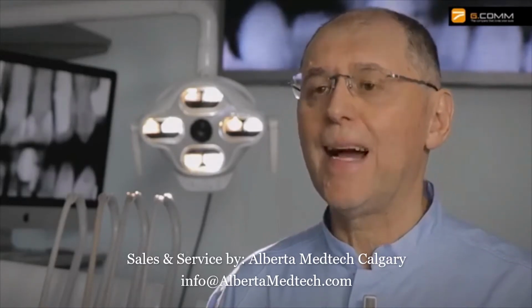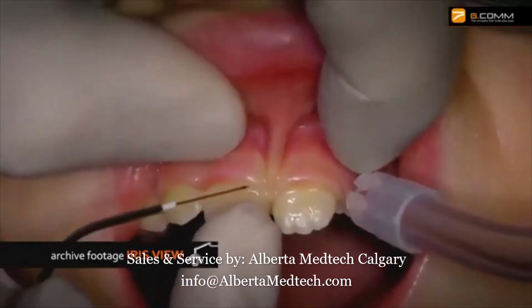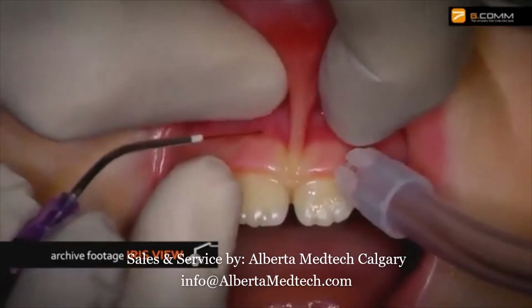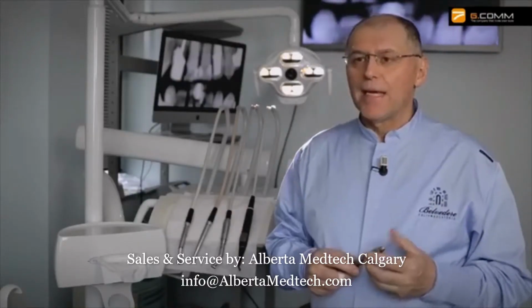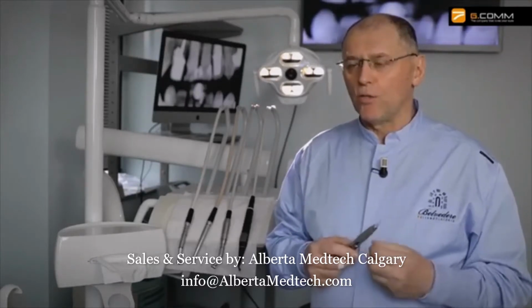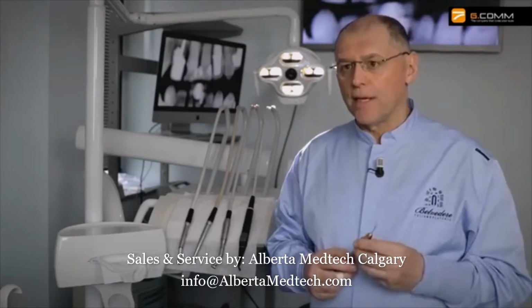Every lamp must have a specific illumination because we have various types of color in the mouth. There tend to be two dominant colors, the white of the teeth and the red of the mucous membranes. We must have a lamp specificity that allows us to modulate the shades of color, therefore all the chromatic effects linked to the mucous membranes or the teeth.